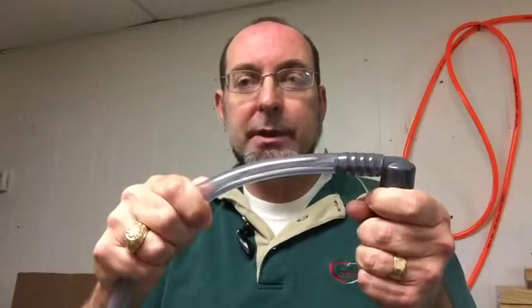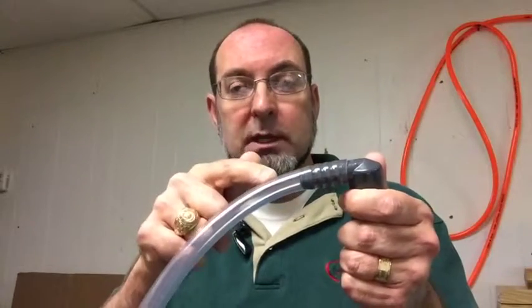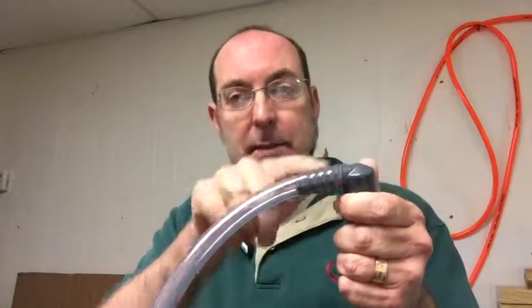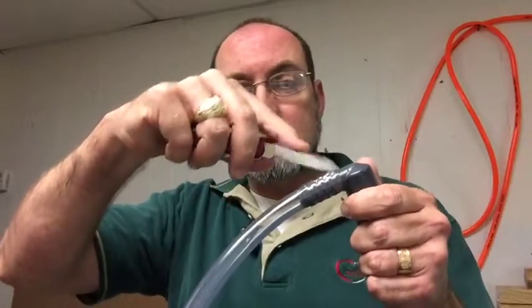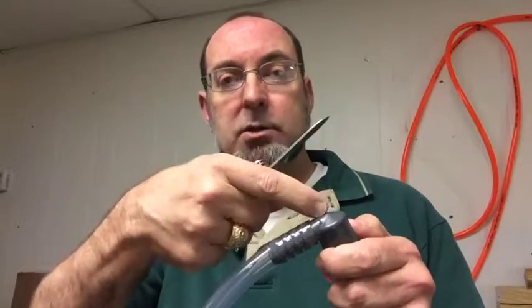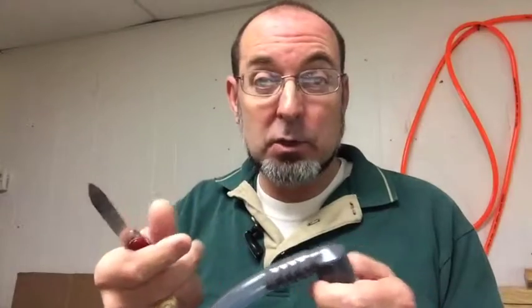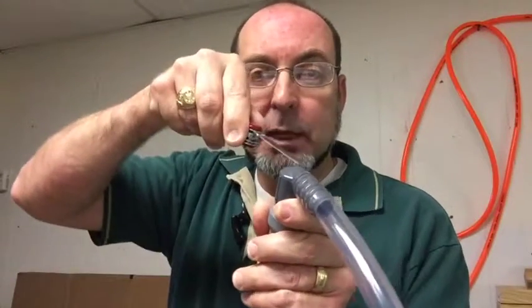I have a clear hose on this one. Our actual hose kits right now have a reinforced hose, which is even more difficult to work with than this, but I wanted to use this so you could see better what I'm doing when I pull this thing off. What you don't want to do is the typical way, which is to just slice down the tubing and pull it off. Well, that's going to put a gouge in the connector so that you really can't use it anymore. So what I recommend doing is taking your knife blade.